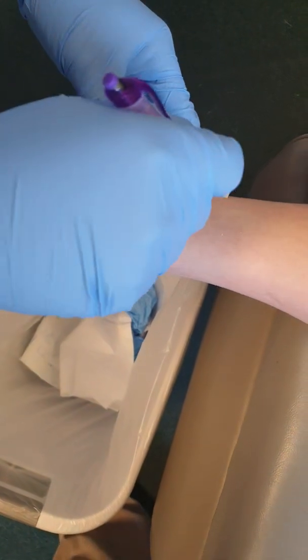Again, 10 centimeters, and we do a mark. This is the mark where we're going to actually do the punch biopsy.